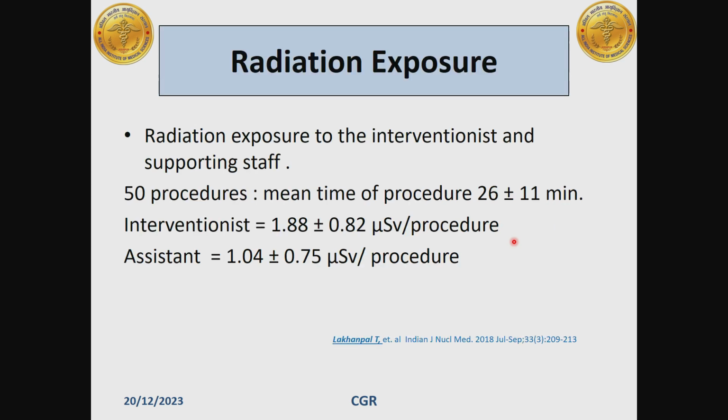Now, one may comment about the radiation exposure. That is a very valid comment because we are administering a radiopharmaceutical, and that too a PET radiopharmaceutical, inside the patient. But the study which I am quoting is from an Indian institute which has done more than 100 procedures of PET-CT guided biopsy, not only with FDG, but also with other radiopharmaceuticals like PSMA and DOPA.